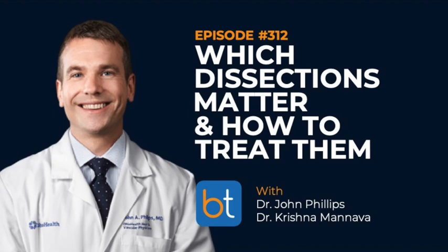You mentioned you went a couple cases below the ankle. Have you, off-label, ever put it in any other unusual places, upper extremity or some other weird location? I have thought about it a couple times in the arm and have punted. We have used it in folks that have come in with acute limb ischemia that we have lysed and done thrombectomy on, and we still can't get rid of some of the clot and nothing is working. I will use it to tack up the thrombus. We've had a couple of cases that it was successful, and that's usually distal tibials.